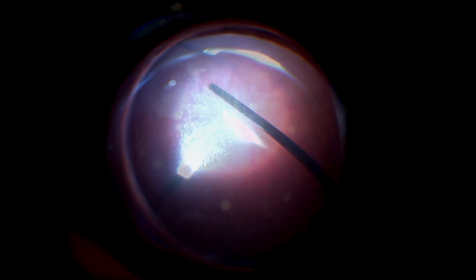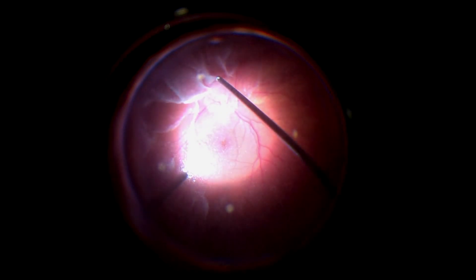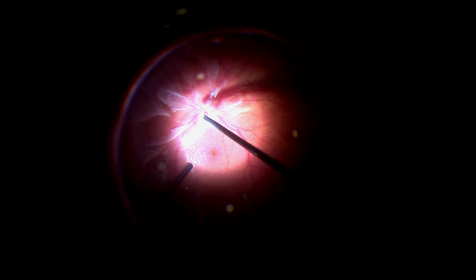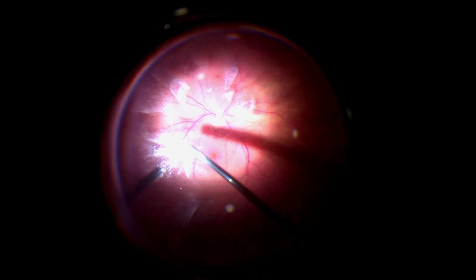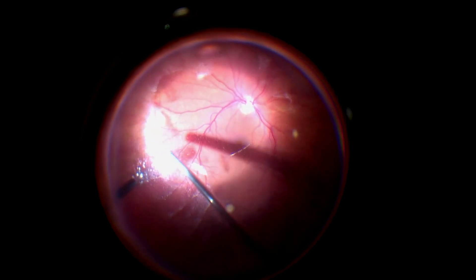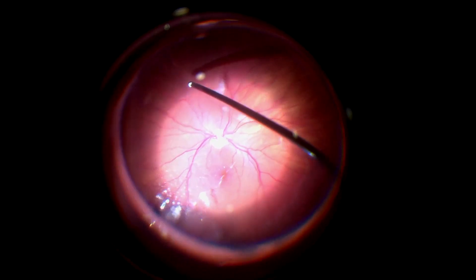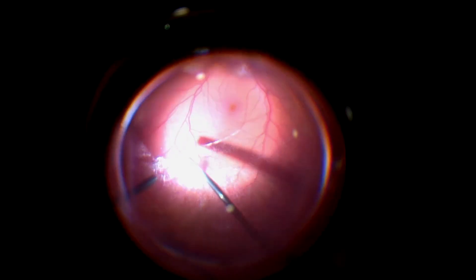I'm going to do my pars plana vitrectomy. This patient does not have a posterior vitreous detachment even though he has really significant floaters, so my plan is to induce a PVD. Here I'm right at the optic nerve, pulling the posterior hyaloid off the optic nerve as you can see here. Once it comes up, fluid generally will start to lift it off and you can start cutting. I'll work my way out into the periphery as I cut. The posterior hyaloid is very nicely delineated by the triamcinolone stain, and I'm going to work my way all the way around, cutting as I gently lift it off the retina to complete the vitrectomy.